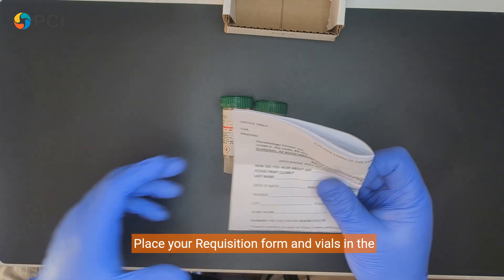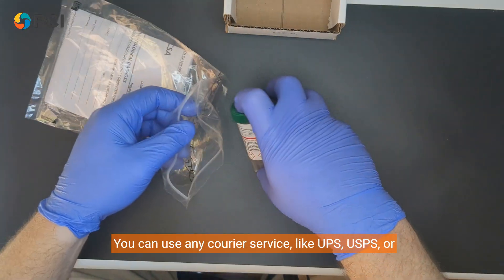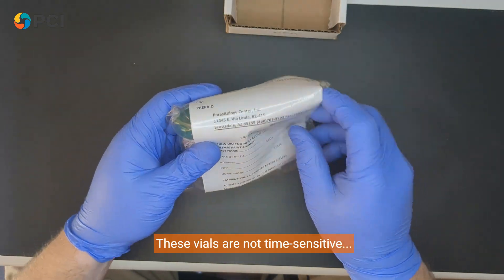Place your requisition form and vials in the provided bag and place them in the shipping container provided. You can use any courier service like UPS, USPS, or FedEx to ship the samples. These vials are not time sensitive.